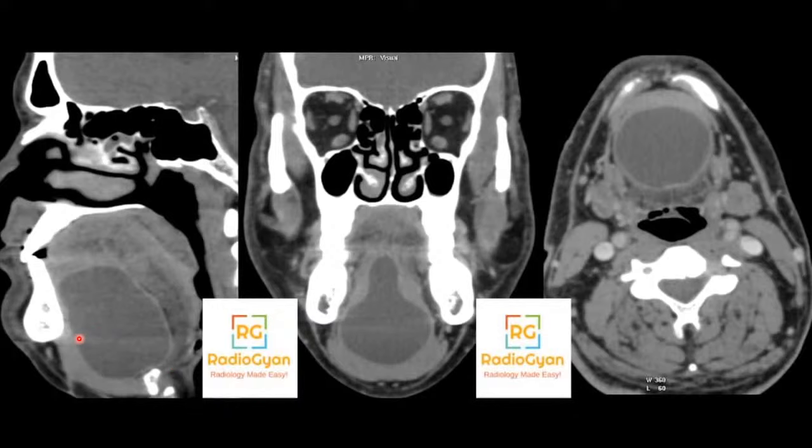So ranula is a cystic dilatation, a cystic structure that we commonly see at the floor of the mouth. It's a retention cyst commonly caused due to obstruction of one of the sublingual glands. I would avoid calling it a plunging ranula because it should go behind the mylohyoid muscle, but here we don't see it going behind the mylohyoid muscle. So a cystic lesion at the floor of the mouth is a ranula. Epidermoid is a differential, but this was a case of a ranula. Yeah, Ronit rightly pointed out there is also a keyhole appearance.